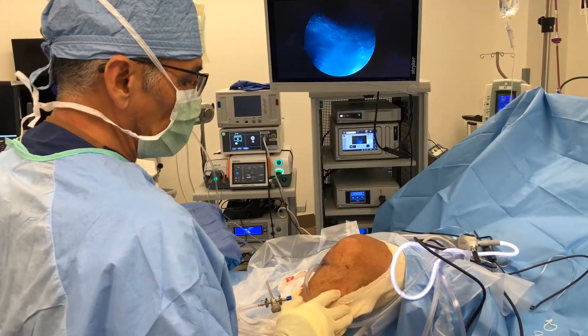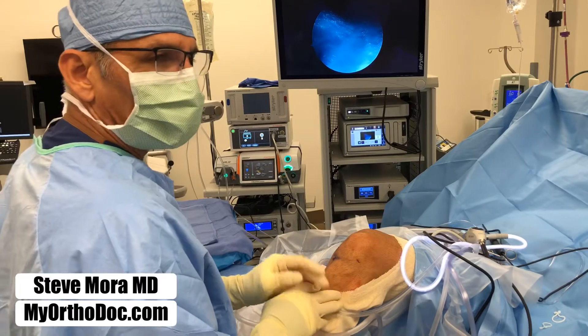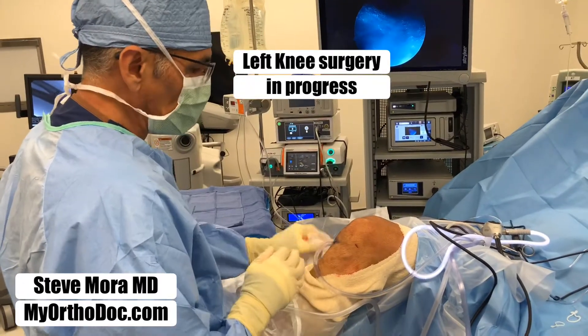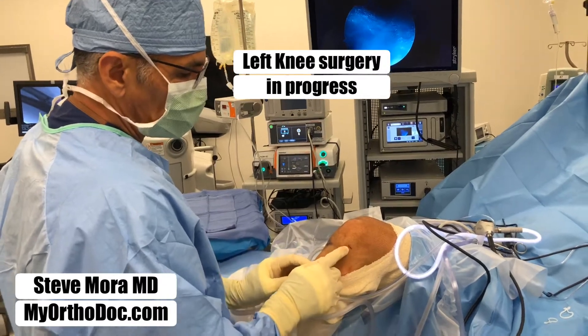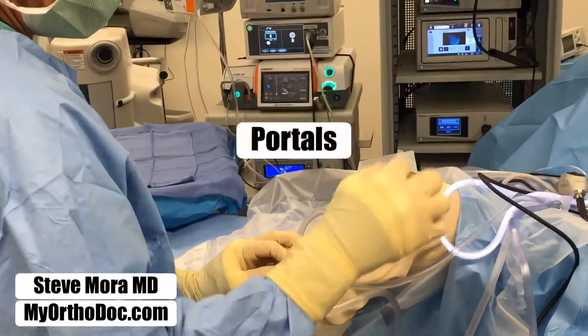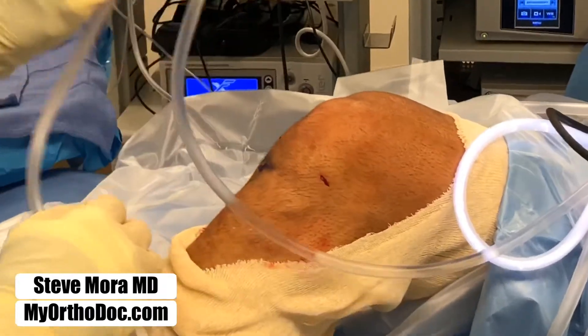We're doing a knee scope on a gentleman with catching and locking on the inner side of his left knee. This is the patient's left knee right here. I just made a couple of incisions — we call these portal incisions. The portals allow us to go into the joint with a scope.